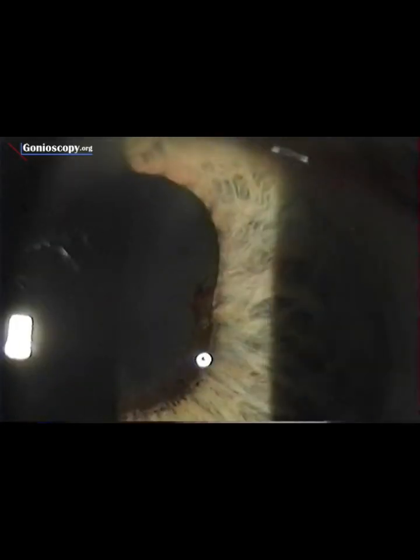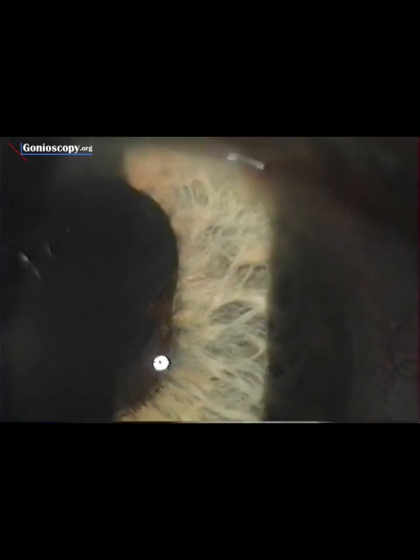This patient had a growing choroidal melanoma for which he underwent iodine-125 plaque therapy. He subsequently developed neovascularization of the iris, as seen here, with fine vessels at the pupillary margin. You'll also notice central posterior synechia. On gonioscopy, he has fine vessels in the iridocorneal angle. Notice that these vessels cross the scleral spur and branch over the trabecular meshwork. Normal vessels would not cross the spur in this manner.